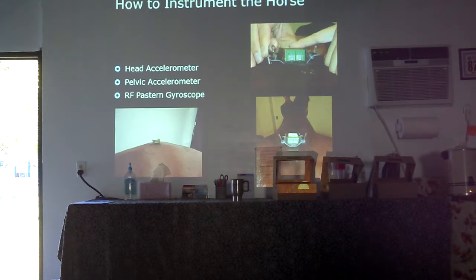Okay, we've done experiments where we have determined that you have to get that pelvic sensor off midline by somewhere between 1/4 and 1/2 the width of the sensor before you start manufacturing results.